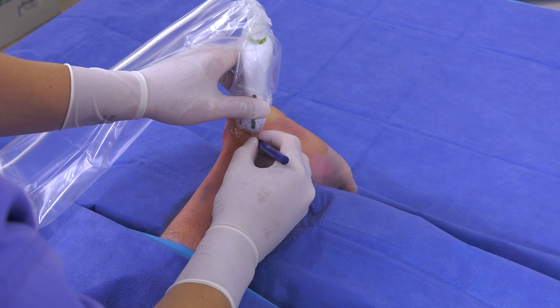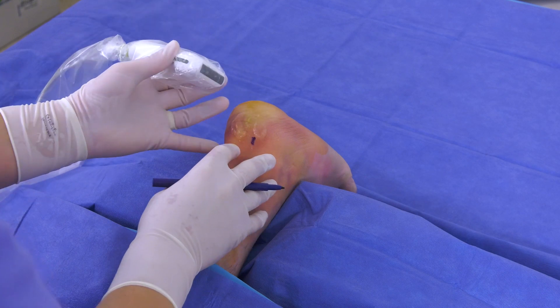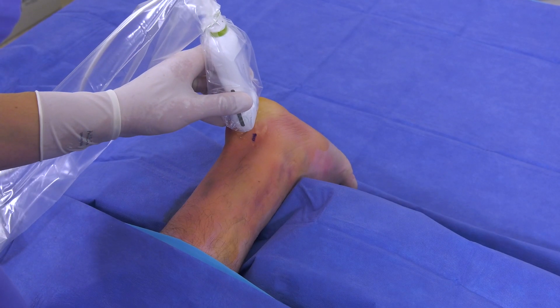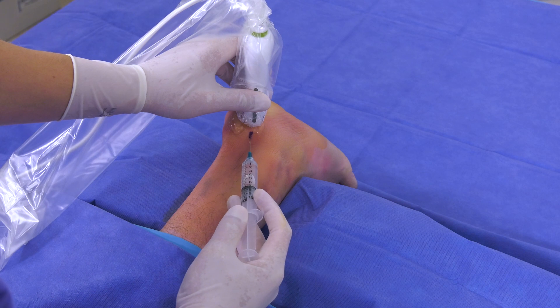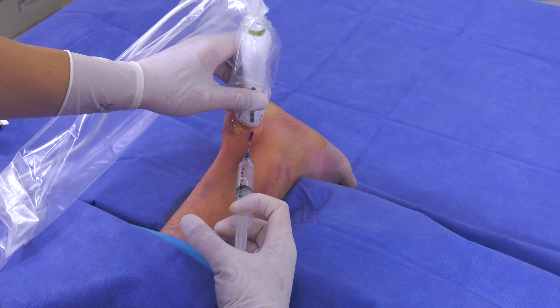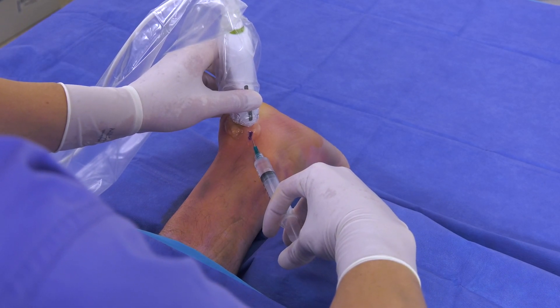To mark the location of my approach I use a sterile marking pen. I approach the Achilles laterally rather than mid-substance for ease of access. To ensure that the patient has minimal discomfort during the procedure, a local anesthetic is administered to the affected area. It is important to do a superficial skin wheal over a wide area, then using ultrasound guidance I direct the anesthetic toward the insertion of the Achilles tendon on the calcaneus.